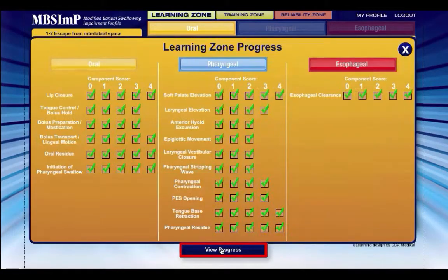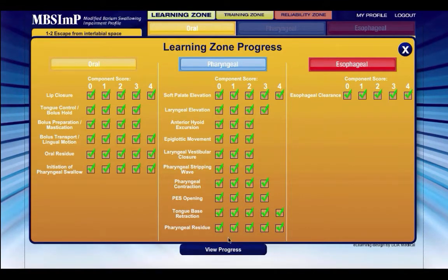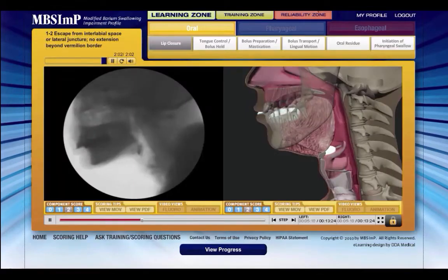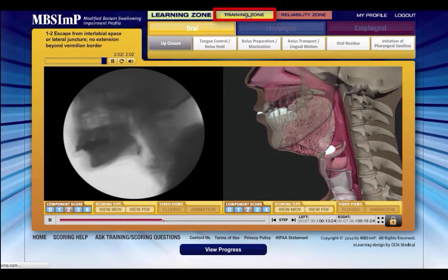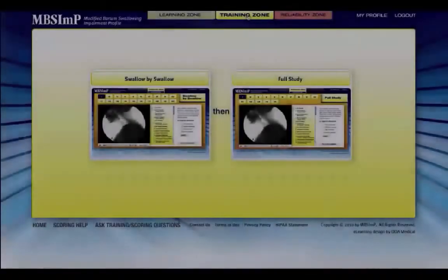You can track your progress at any time by selecting the view progress icon. Every score for each of the 17 components must be viewed at least once before access is granted to the training zone.